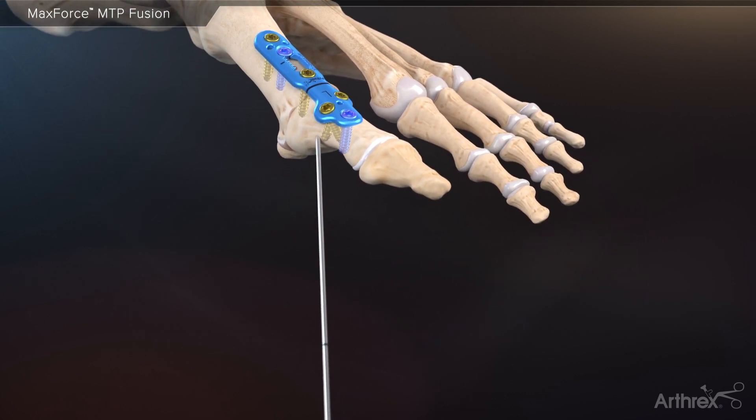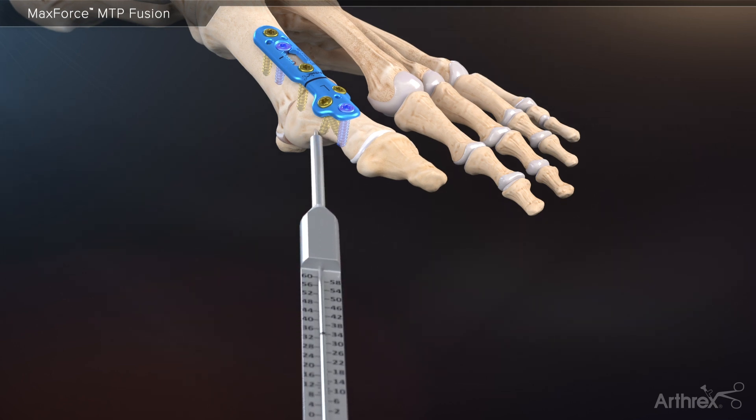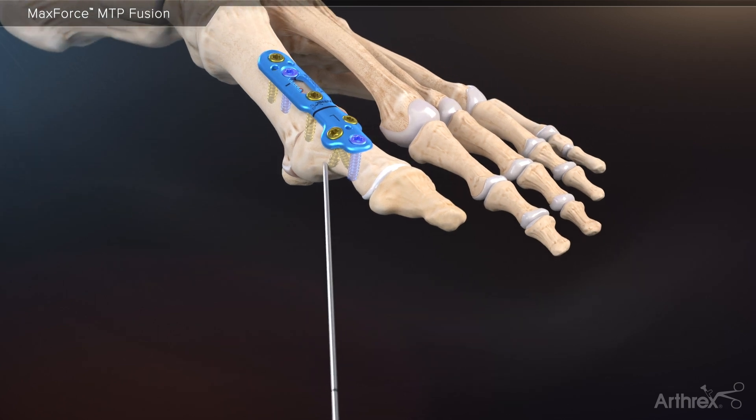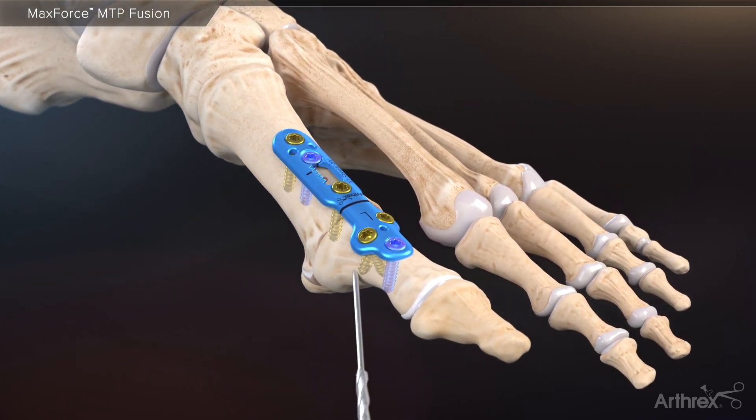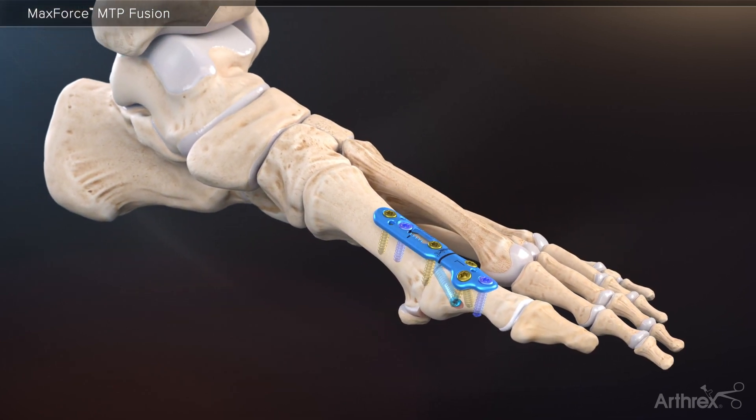Finally, to complete the fusion construct, a 3.5 millimeter compression FT screw is inserted across the arthrodesis site. First, measure with the cannulated depth gauge. Drill and insert a 3.5 millimeter compression FT screw to further compress and stabilize the joint. With this third mode of compression, the MaxForce MTP plating system allows surgeons to achieve more than 2.5 times the standard amount of compression compared to traditional MTP plate and screw constructs.